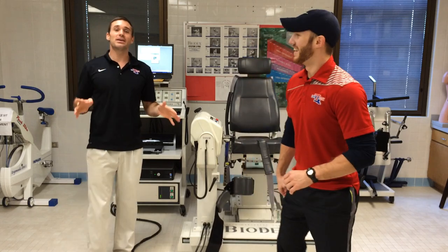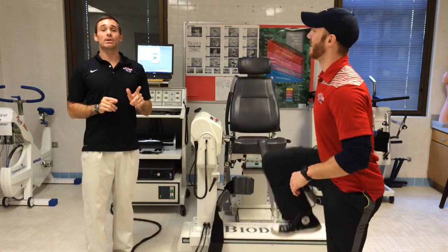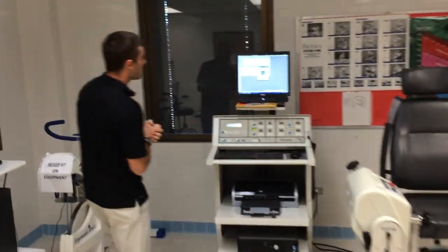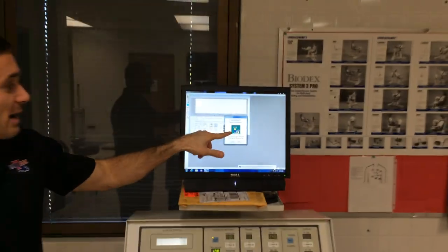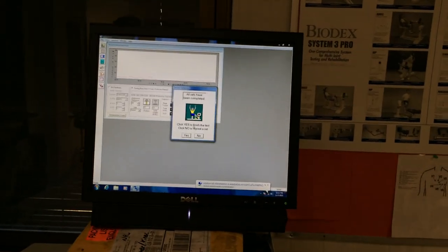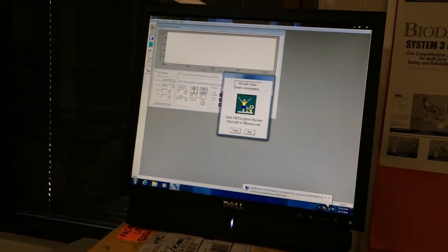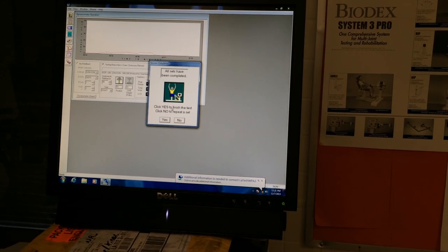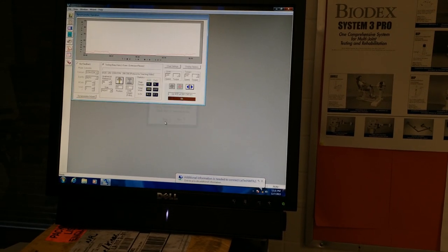And we have finished the test. The last things that we need to do, we come back to our computer. We'll see our little guy right here. He's cheering us on. He's all happy. He's all finished. All sets have been completed. Click yes to finish the test. Click no to repeat. Since Bo does not want to repeat, we will click yes.